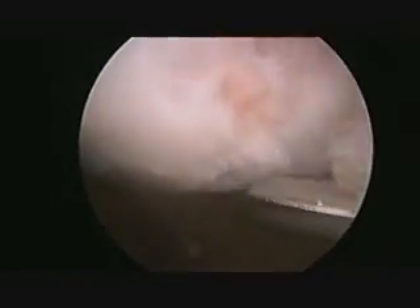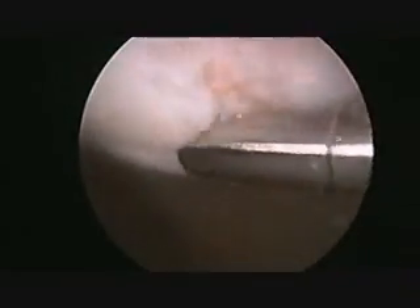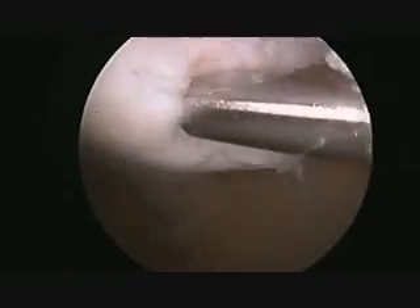In this situation, it came off of the medial aspect of the patella or kneecap during a patellar dislocation. There clearly is a large amount of loose chondral debris as well as exposed bone in this location.